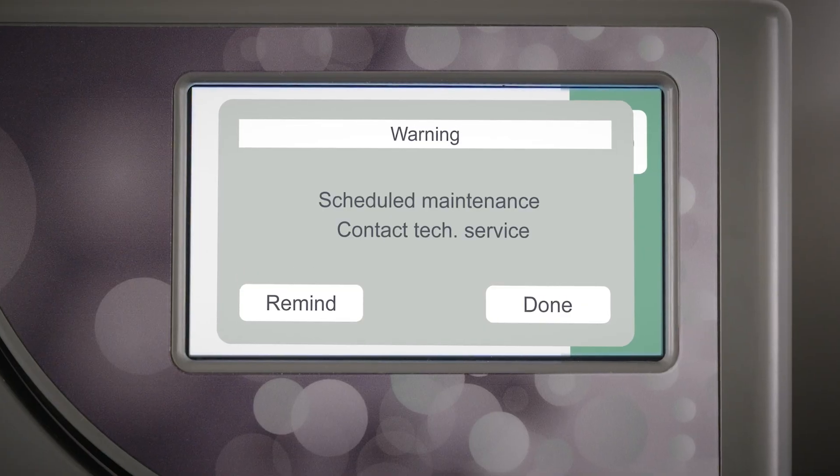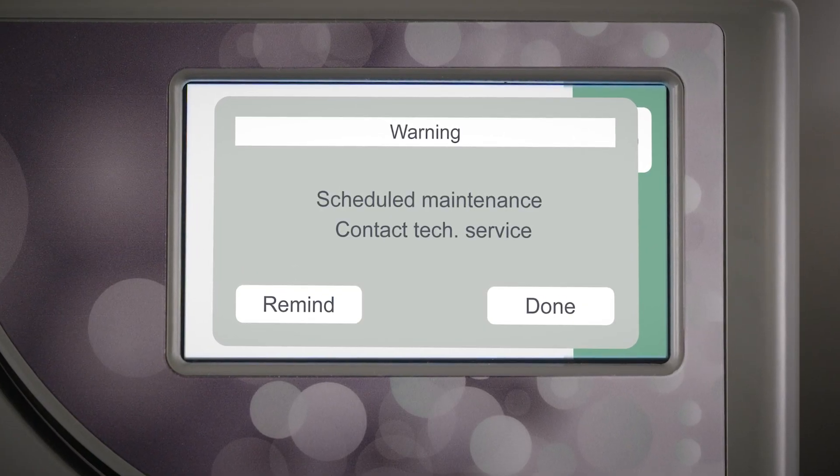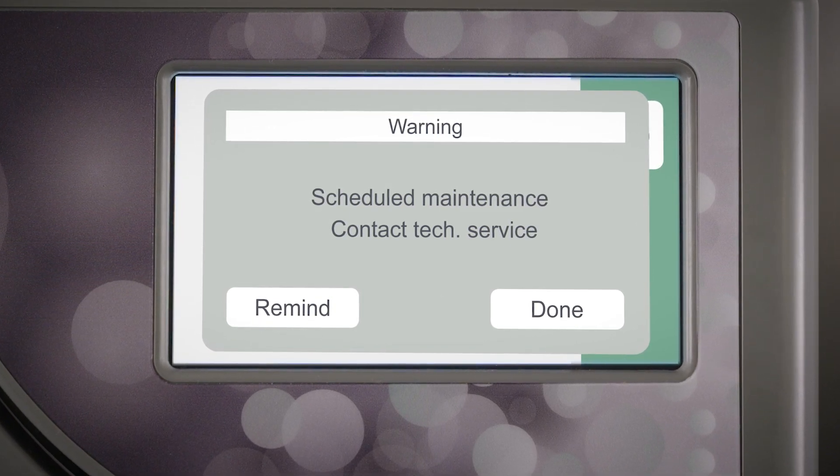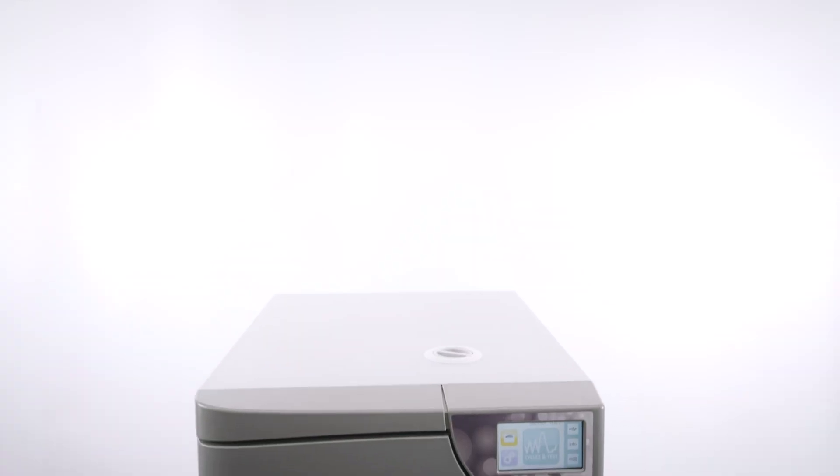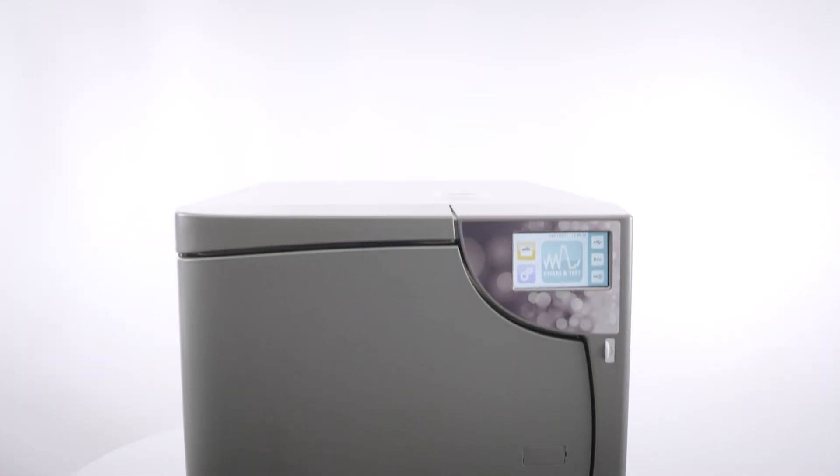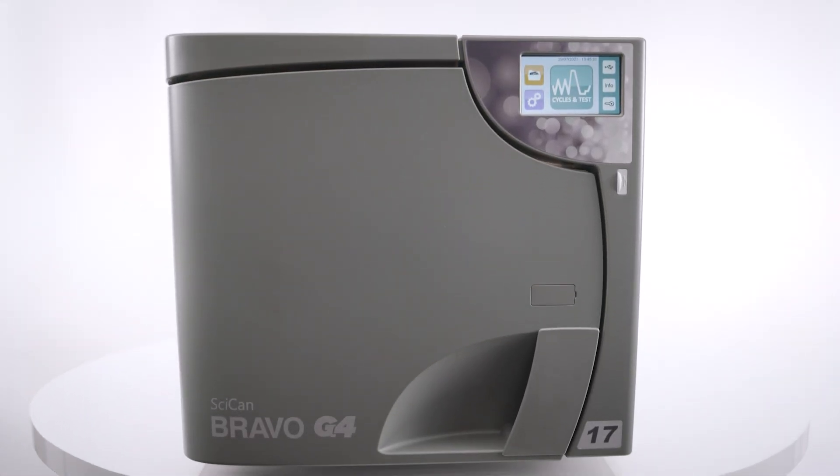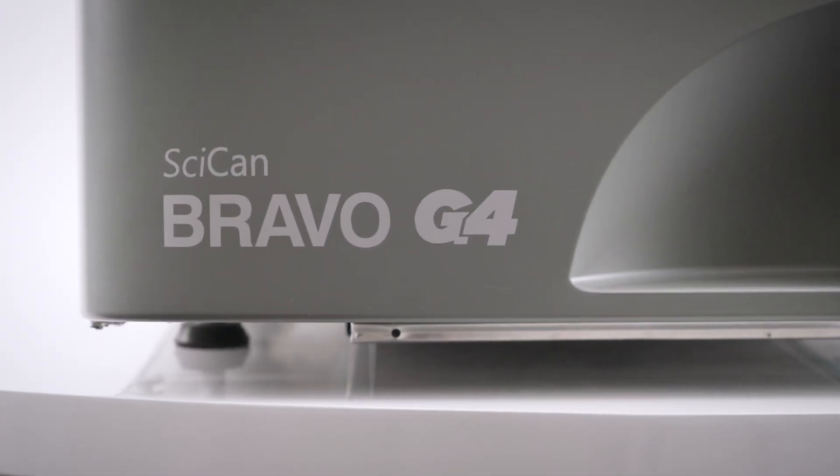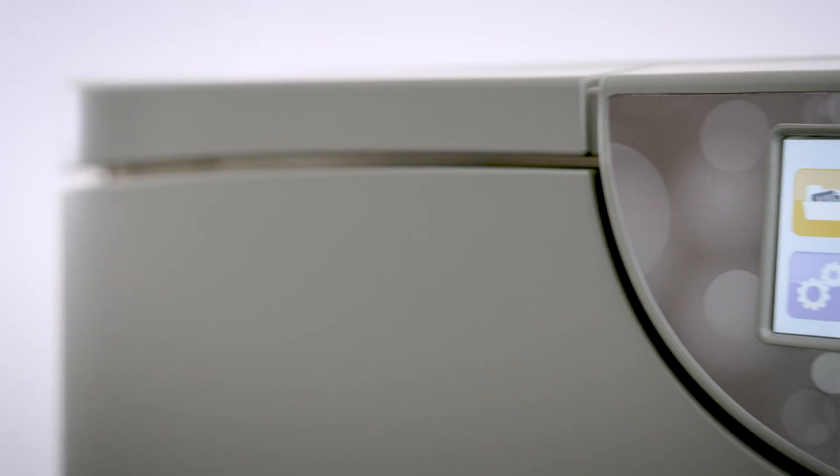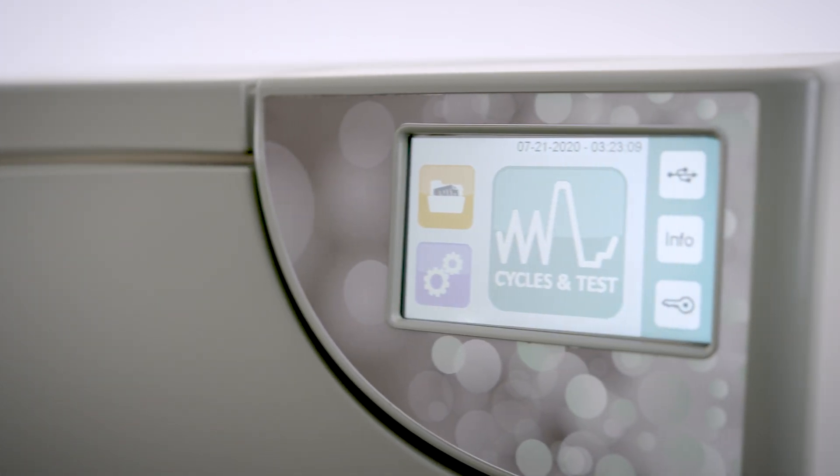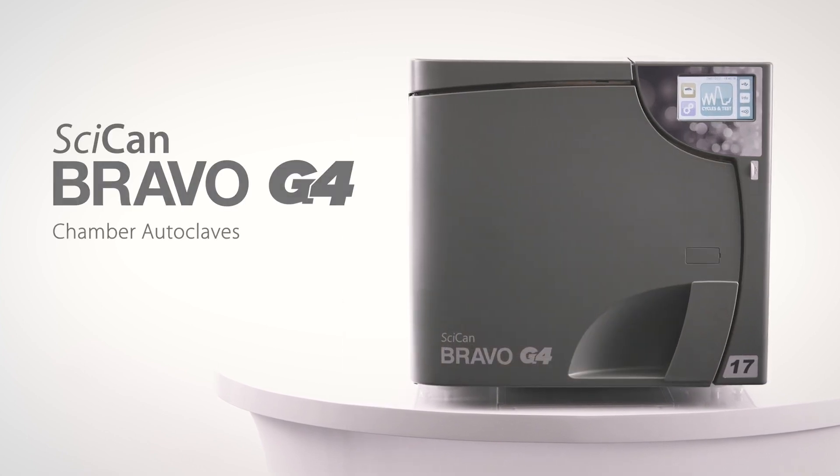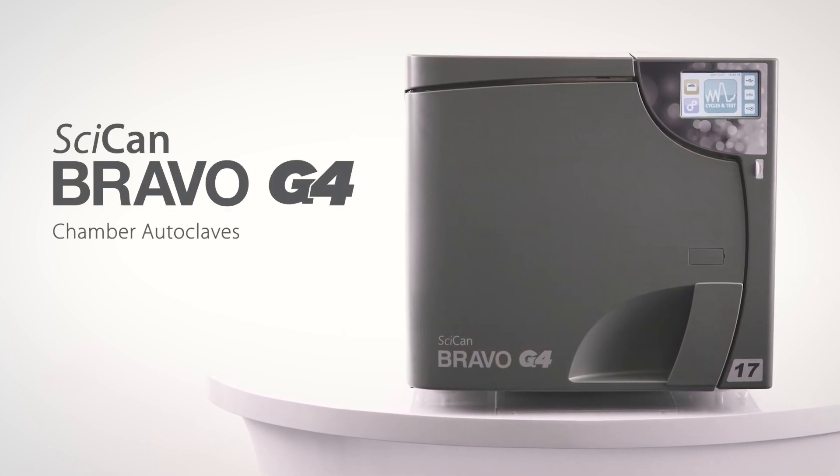The Bravo G4 will also display an automatic maintenance warning message for general service every 3000 cycles, which is roughly every three years. Additional details about installing, operating, and maintaining your SCICAN Bravo G4 are all contained within the operator's manual. Please read these instructions before operating this unit and keep them for future reference. Thank you again for making the SCICAN Bravo G4 part of your sterilization upgrade.